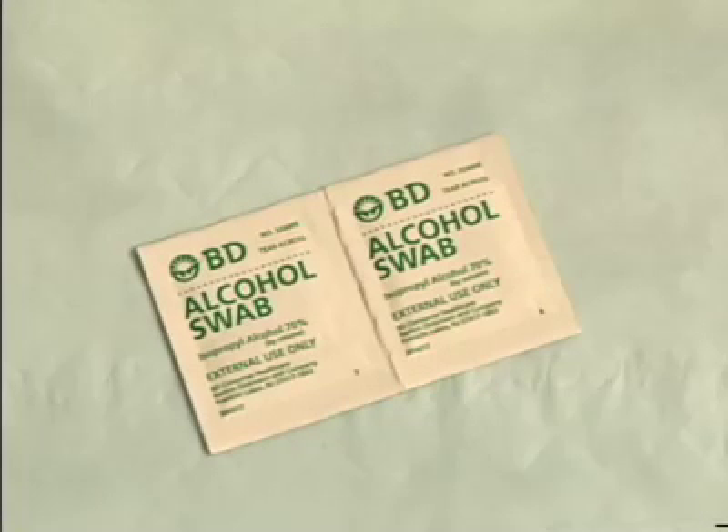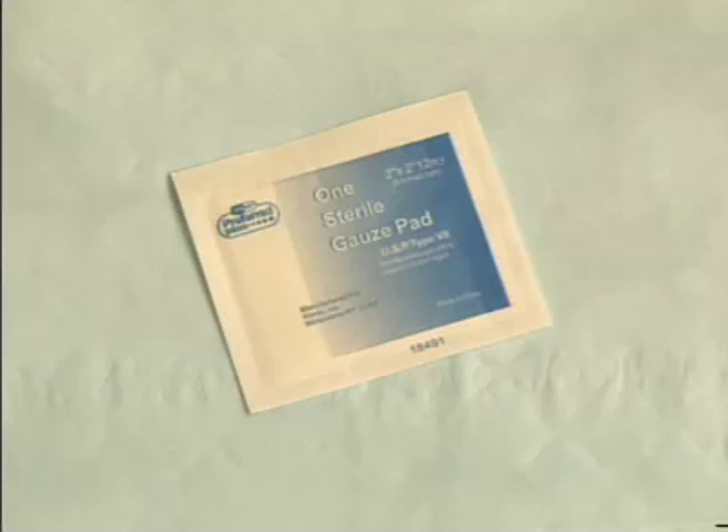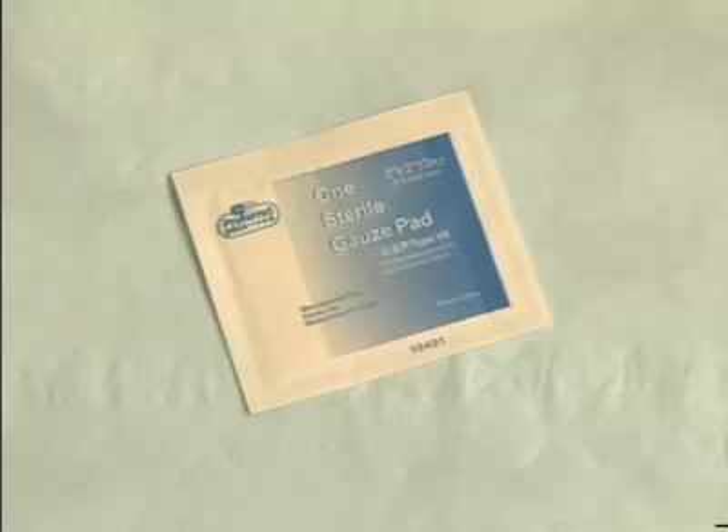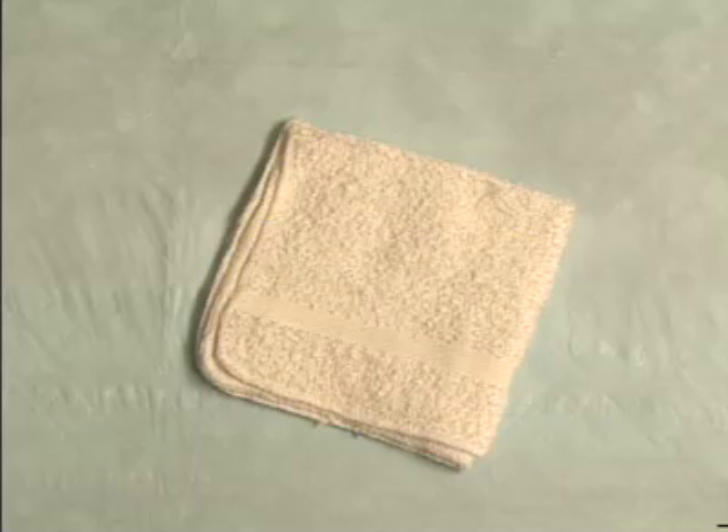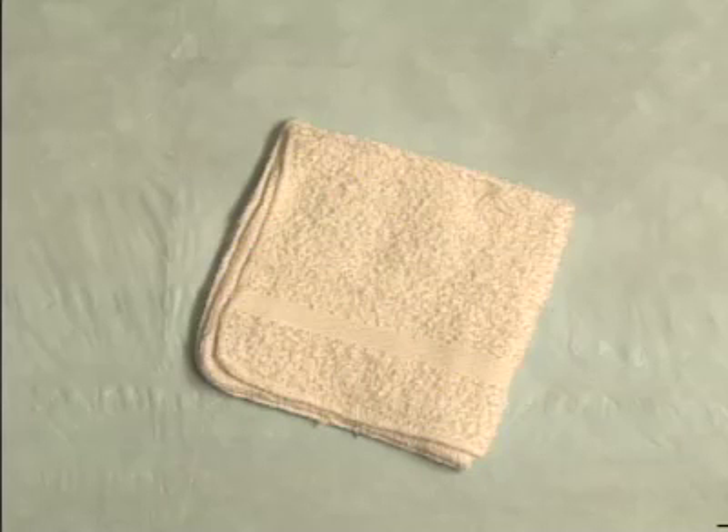Standard supplies include 70% isopropyl alcohol swabs, sterile 2 inch by 2 inch gauze sponges, puncture-resistant sharps container, disposable gloves — non-latex if the child is allergic — a towel or washcloth to warm the heel if necessary, a marking pen and laboratory requisition slips.